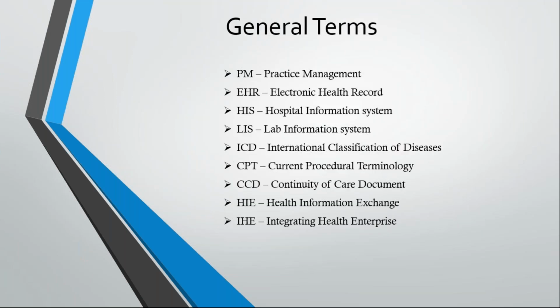Before jumping into the actual hospital workflow, we'll see a few general terms that we need to be aware of before jumping into the training, because we'll be using these acronyms a lot while talking about the functional parts of HL7. PM is nothing but practice management.